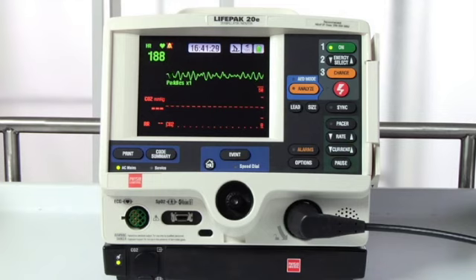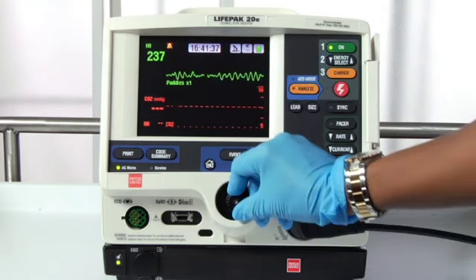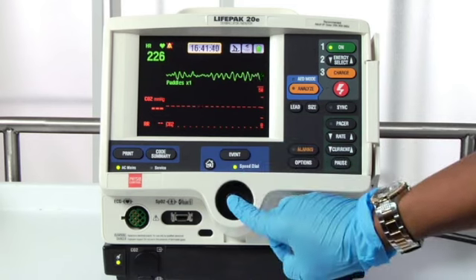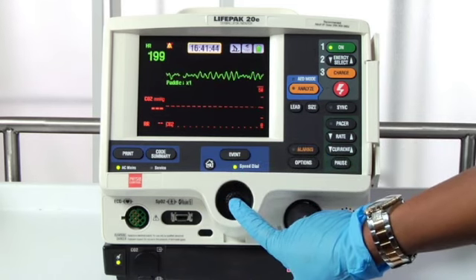The 20E is on, we're in manual mode, and we have confirmed that the patient is in cardiac arrest. The clock displays real time. To display elapsed time, use the speed dial to select the clock. Each time you select the clock, it switches between real time and elapsed time.